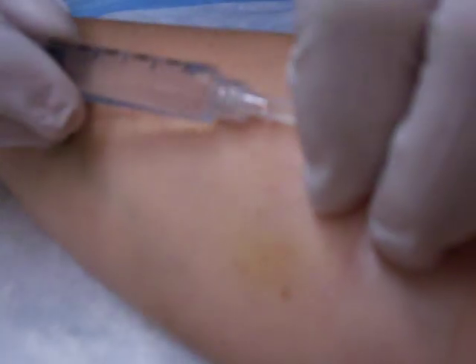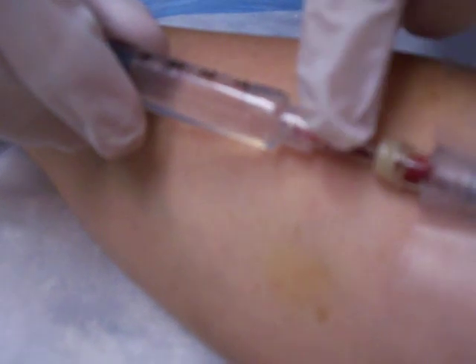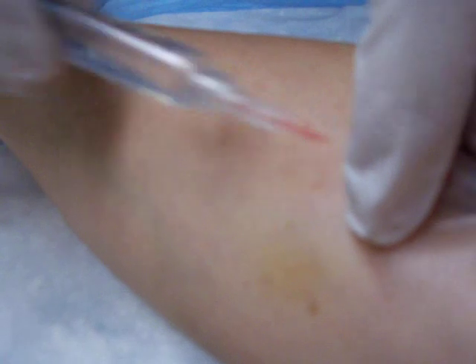This is just some salt solution just to clear the line and make sure that we get blood back and it's nice and patent — as we call it — or open.